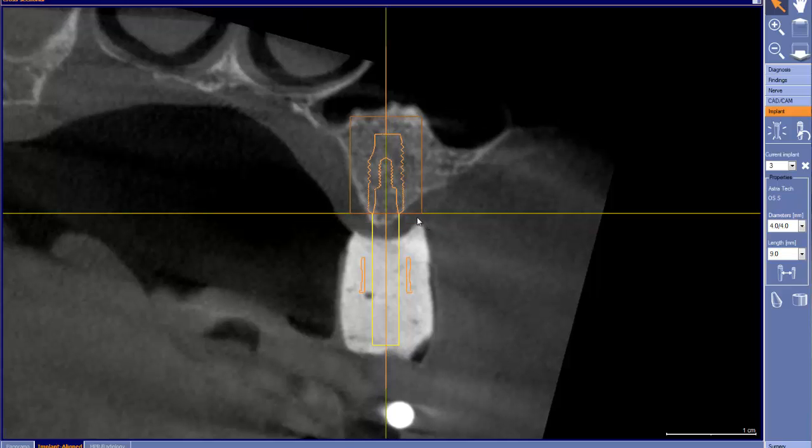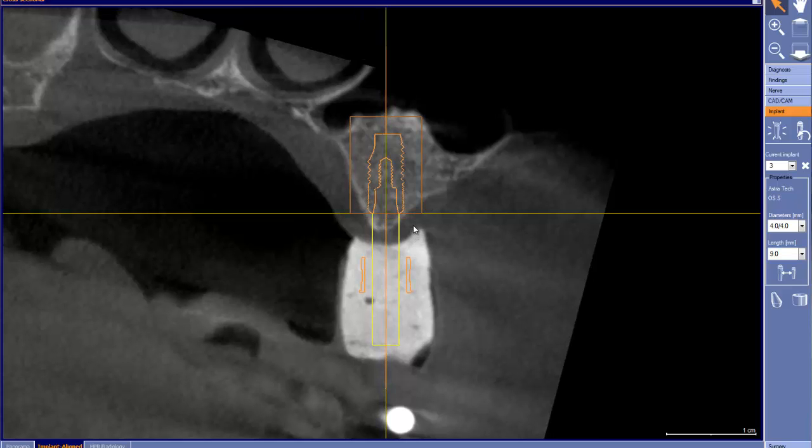Again, my issue with placing it this close is that with this particular brand of implant, we still take a risk of it showing. So, as was done here earlier, I would go ahead and drop this implant to about this level. This also gives us some bone around it and gives us good ability to create a nice emergence profile. So our bone level on this particular implant was nicely done.